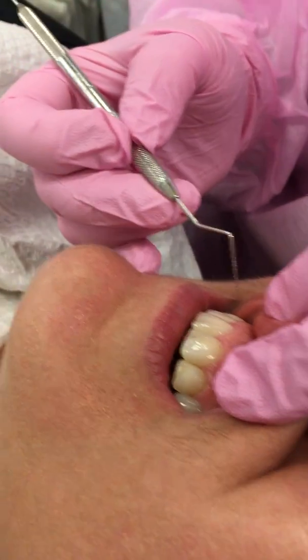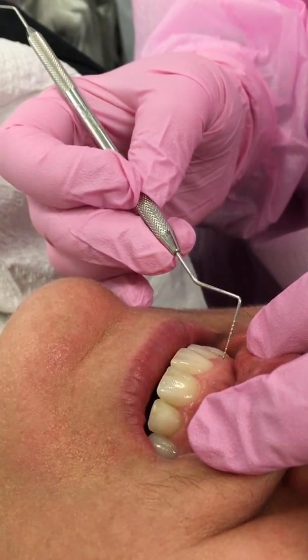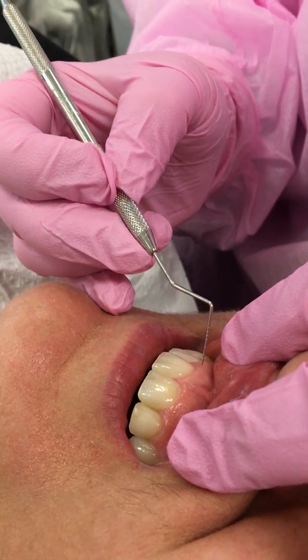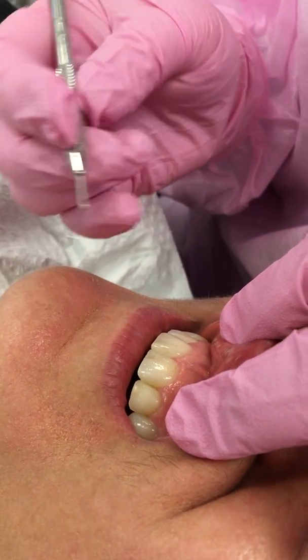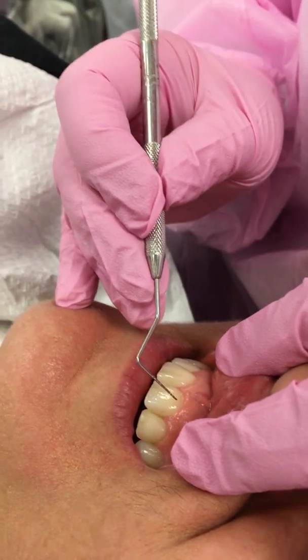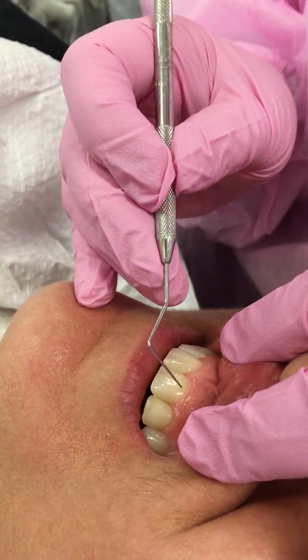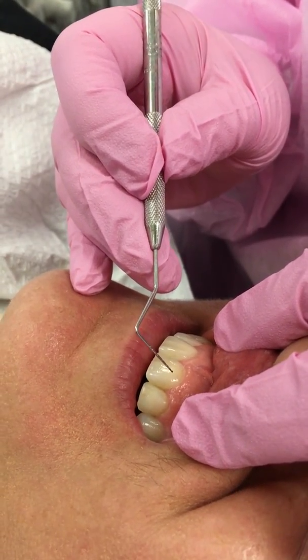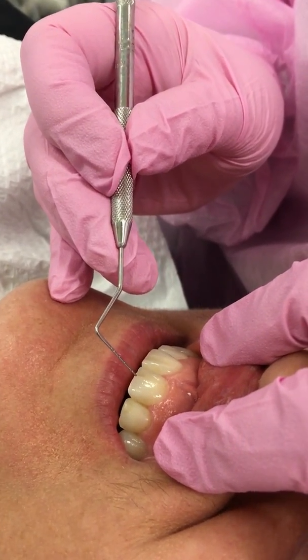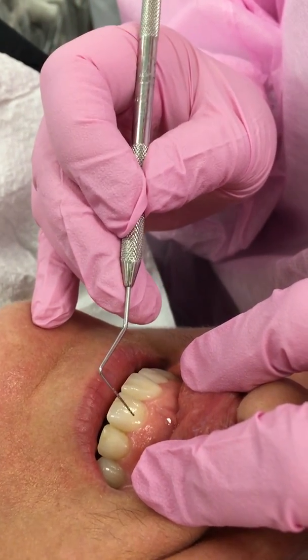And if you look real closely, she's got a nice little indentation or groove right there. Do you see it? Okay, and what was that called? Free gingival groove. All right, and the free gingival groove is an indication of what? Where the gingiva attaches to the tooth. And what's it called? The junctional epithelium. So it's an indication of where the junctional epithelium is.